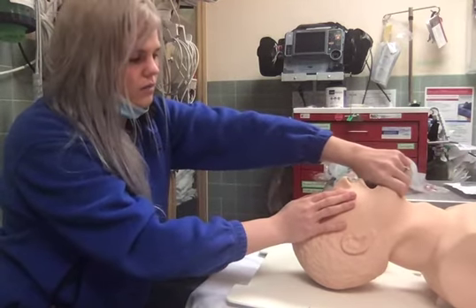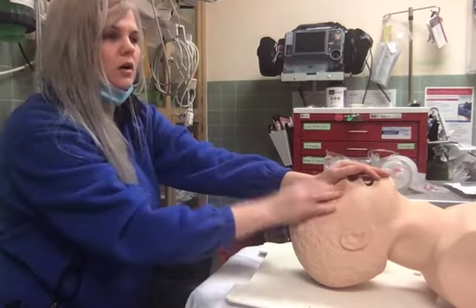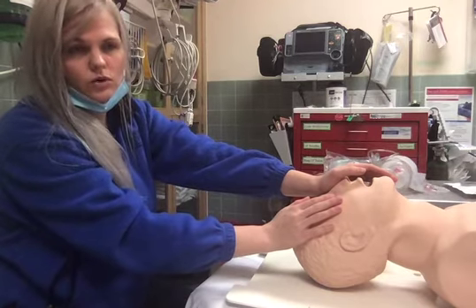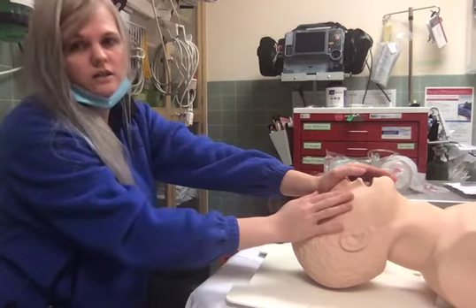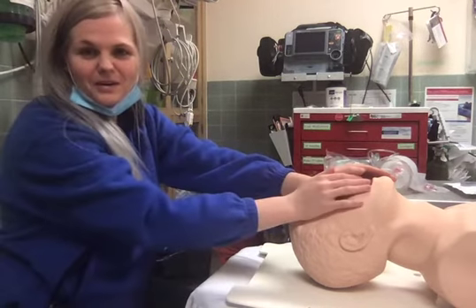airway. Once you attach the BVM to it, you want to start making sure that you in fact have it in the correct place. You will know that based on the fact that you get some chest rise. If you don't get chest rise, this is something that took me a couple of years to kind of figure out.